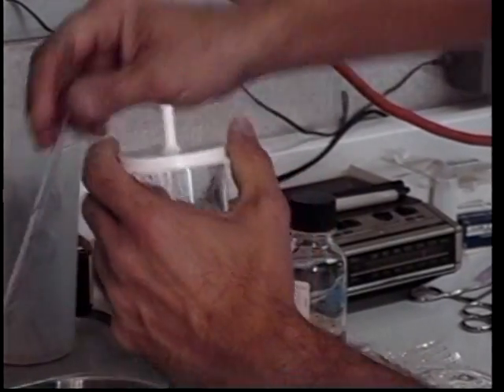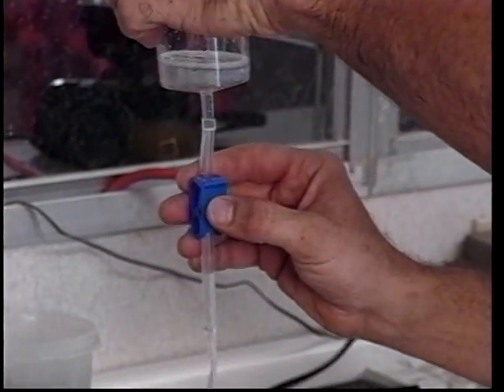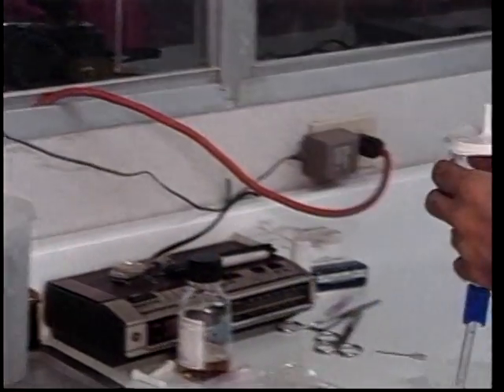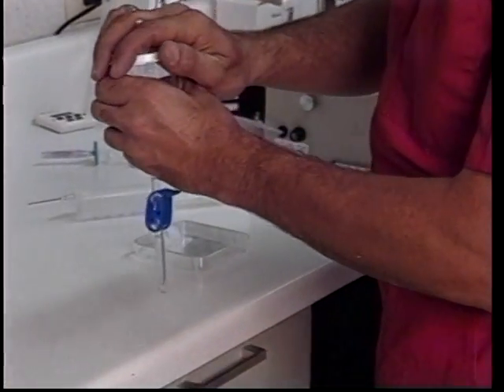Once in the laboratory, the embryo filter needs to be removed from the tubes. We then drain this fluid off the bottom until we have an extremely low level of fluid left in the filter. The top is then removed.